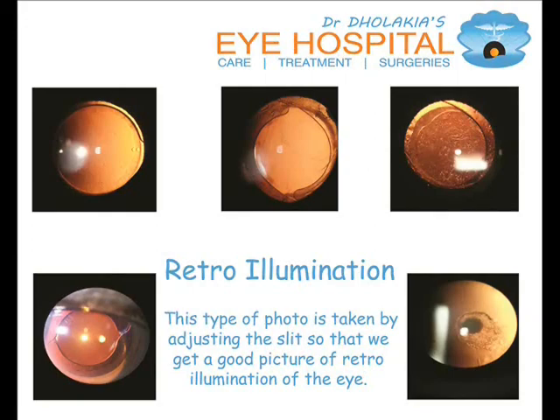Retro illumination: this type of photo is taken by adjusting the slit so that we get a good picture of retro illumination of the eye.